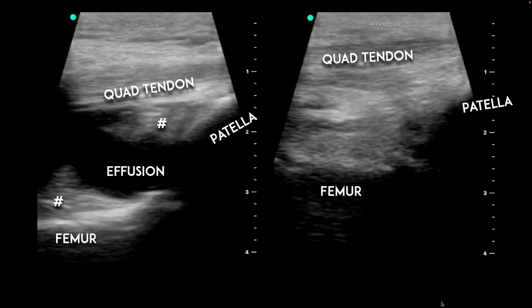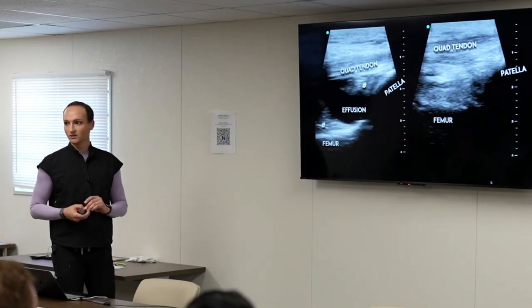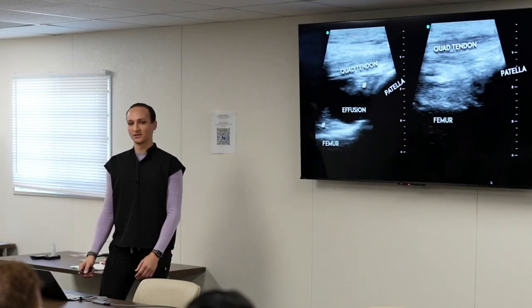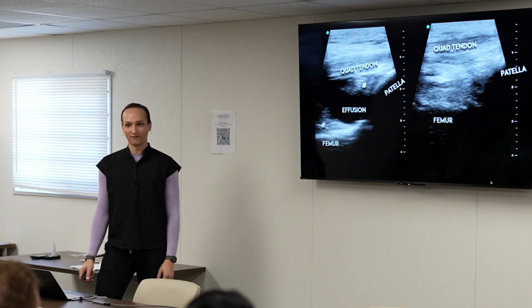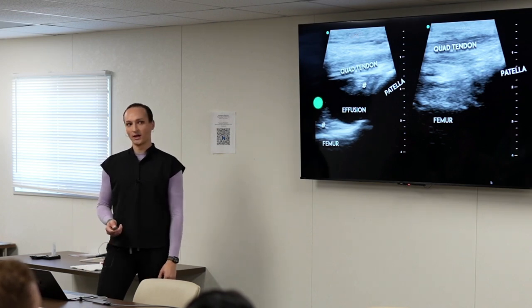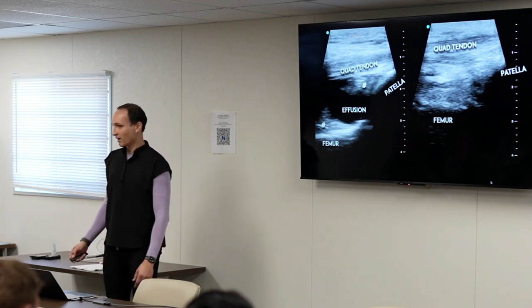Those little hyperechoic things attached to the femur and underneath the quad tendon are fat pads — always normal. There's always a little bit of fat in joints. They're just normal fat pads.